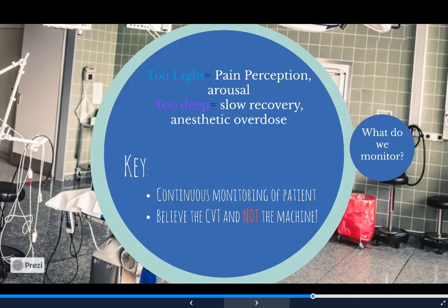So we were monitoring under anesthesia and it was really weird that patients were waking up. And granted, our doctor was getting mad at us for that. And I'm like, I don't know, I know how to monitor animals under anesthesia. I don't know why they keep waking up. So we called someone in to look at the vaporizer. When they looked at it, they were calibrating it, and where we had 5% isoflurane, it was only reading barely 1%. So that's why our patients were waking up. That is also really important, that we're taking care of our vaporizers appropriately, and then we can keep our animals under anesthesia appropriately as well.